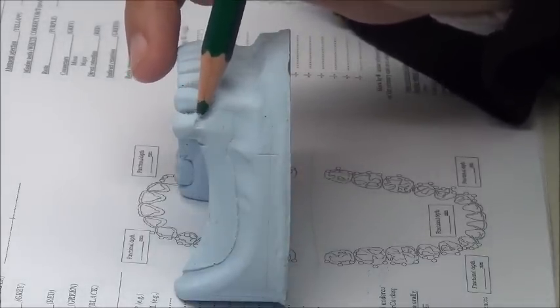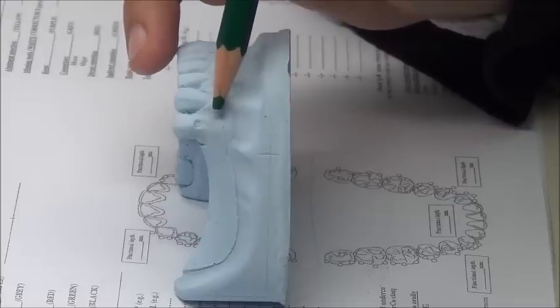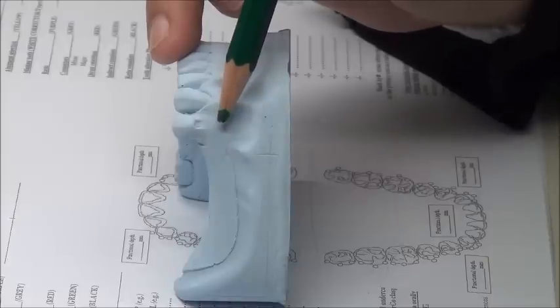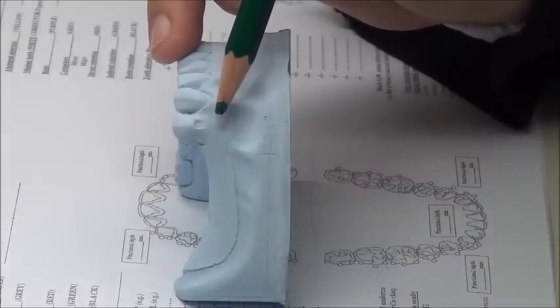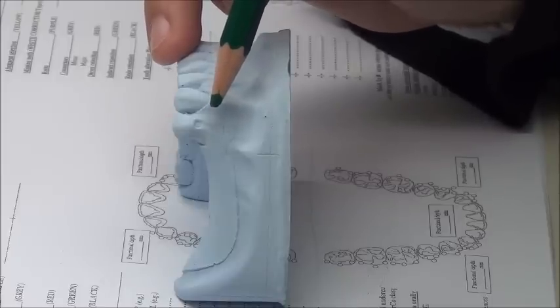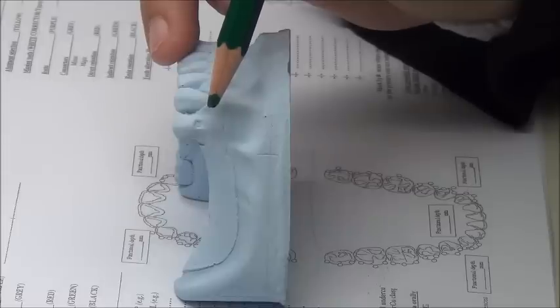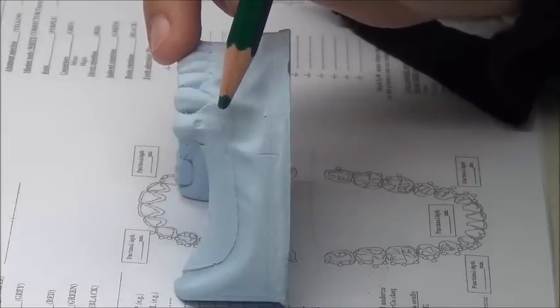Its relationship with the survey line occlusally: it's below it, in the suitable undercut, a measured undercut. Not just any undercut. I have to measure it using the undercut gauge. Its relationship with the gingiva: it's above it. How much above it? Depending on the clasp. Circumferential clasp, 1 millimeter at least, while for all the gingival approaching clasps, at least 3 millimeters.